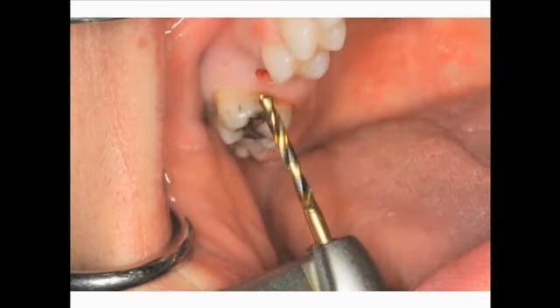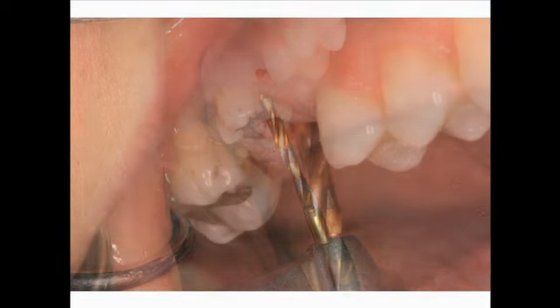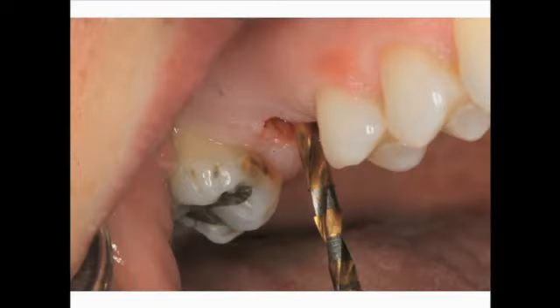These next 3 slides demonstrate the next size drill, which is a 2.2 diameter twist drill, used to establish the final depth of the implant. The black lines are clearly delineated at 7 millimeters, which is the bottom of the first black line, 9 millimeters, the top of the first black line, 11 millimeters, the bottom of the second black line, 13 millimeters, the top of the second black line, and 15 millimeters, which is the third thin line.